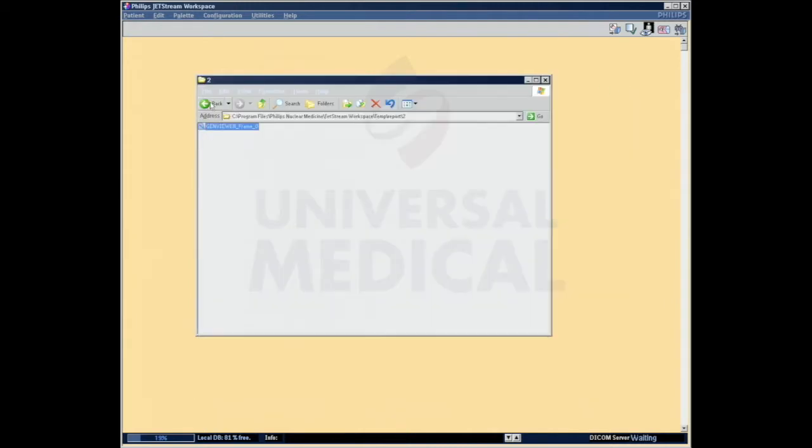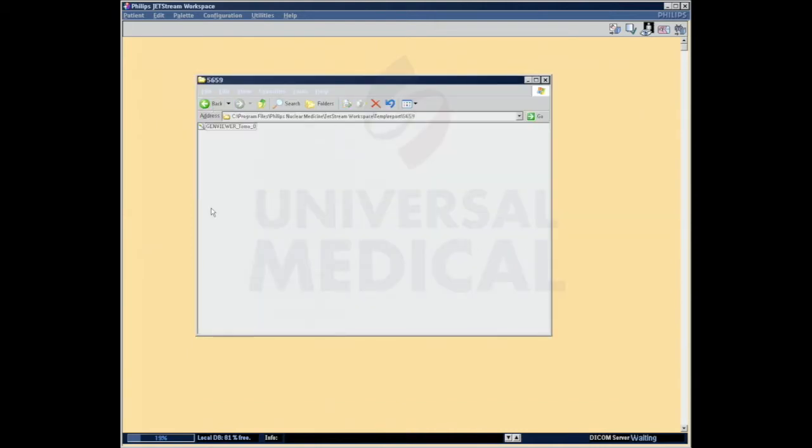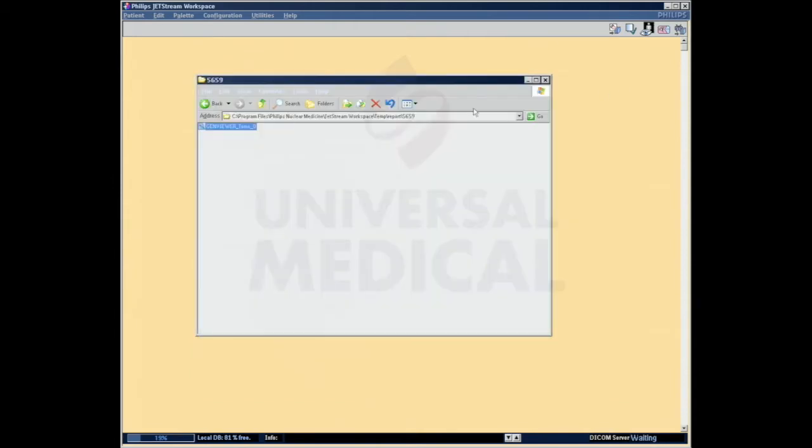Well, if you have thousands of these files or these directories, you're going to have a lot of space utilized. I recently had a customer who had over 40 gigabyte of space utilized in the report directory. And even though he had really shrunk down the number of patients that he had on his system, he still had no space. We got rid of this data, because it's old, it's not useful anymore, and things were wonderful. So you can see that you can have images from QC pictures. You can have a result from a TOMO scan from an example patient. There can be whole body pictures, all kinds of things, and each of these can be quite large.